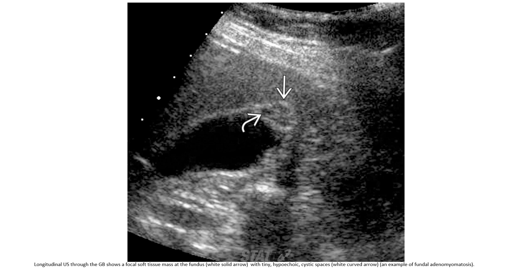And this is the second case of gallbladder ultrasound, so the focal tissue mass at the fundus with tiny hypoechoic cystic spaces. So this is the case of fundal adenomyomatosis.